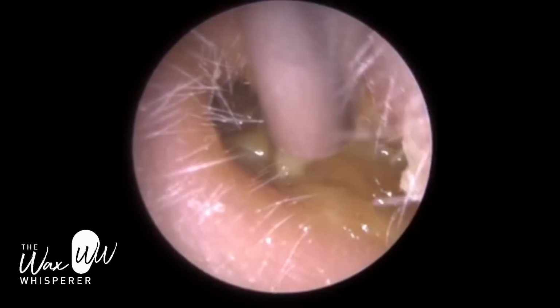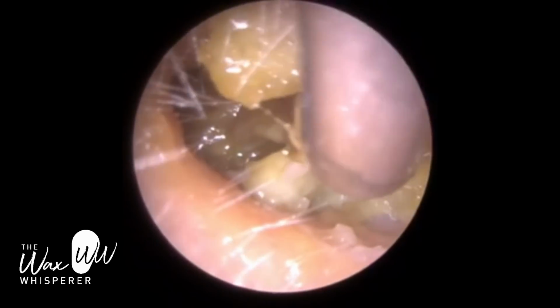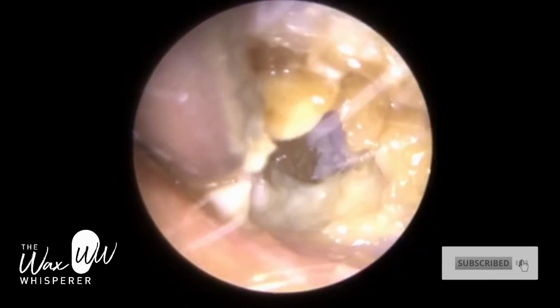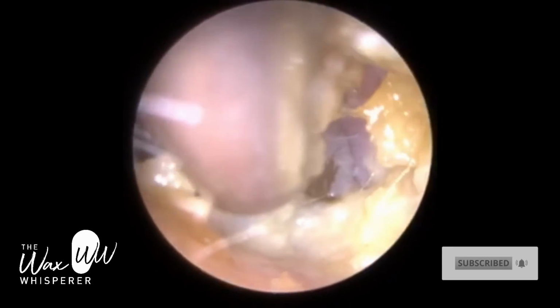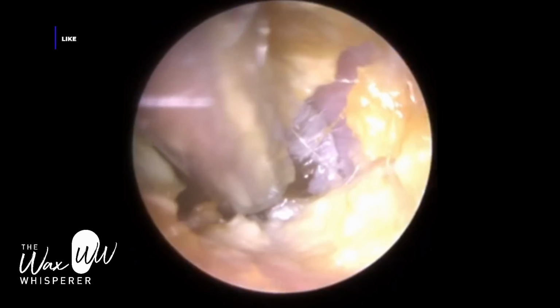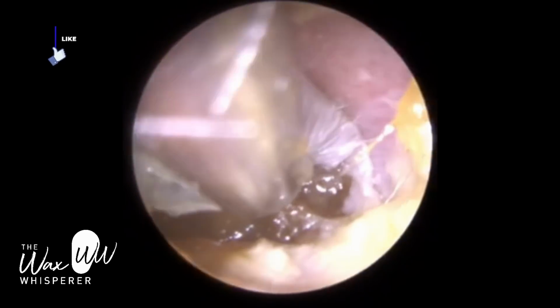This video I've aptly named the Overdosed Ear Wax, for anyone nursing a hangover from yesterday. So this patient attended and they should have really come a lot sooner, but they've been using earwax drops for several weeks in the hope that it would have eradicated their problem.